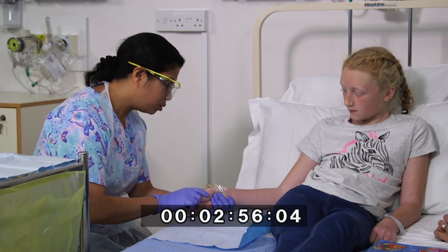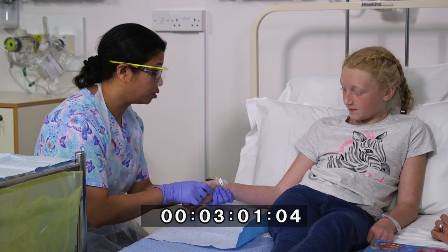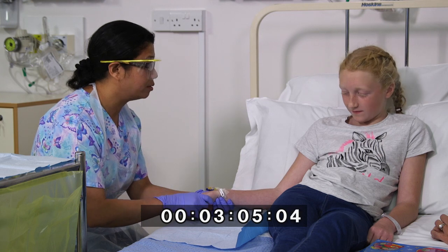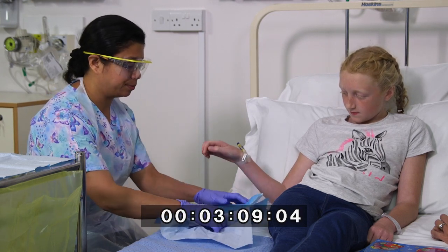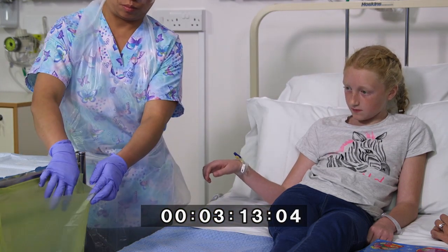She observes the site for signs of swelling or leakage and asks Sarah if she is experiencing any discomfort or pain. Nurse Emma removes the disposable sheet, gloves, and eye protection and discards appropriately. She performs hand hygiene.